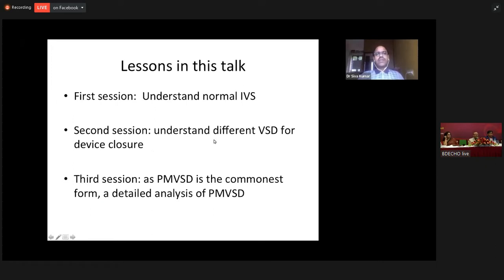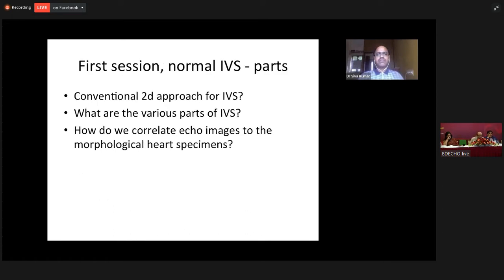I'm going to divide this session into three parts. The first part will be to understand the normal intraventricular septum. The second part will be to understand the different forms of VSD for device closure. And the third session will be a detailed analysis of perimembranous VSD, since it is the commonest form.